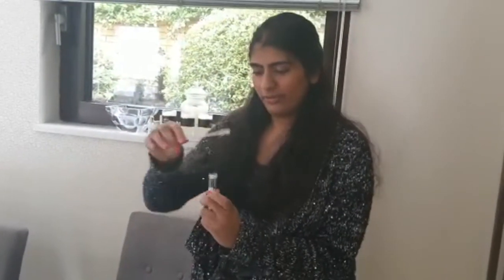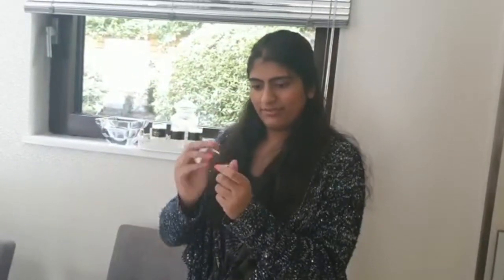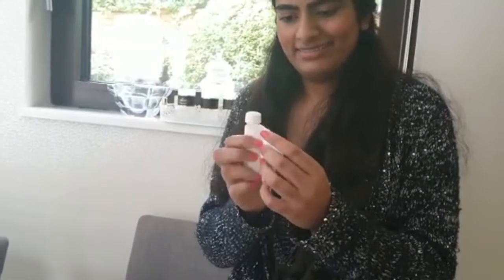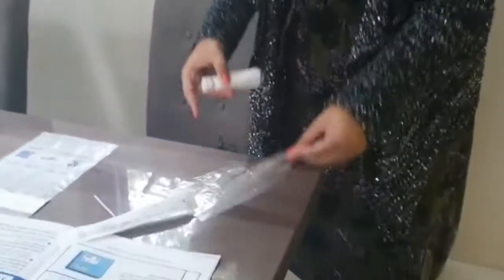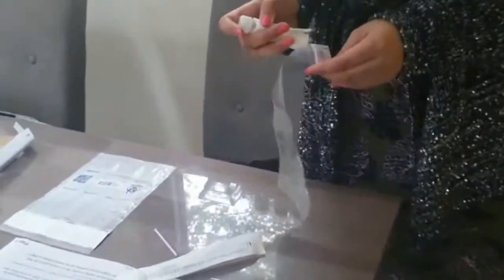Leave the liquid in it and then dip the swab in there, snap off the end, and then close it. You've got the tissue wrapped around it, then you put it in the bag, then the second bag, and then into your box.